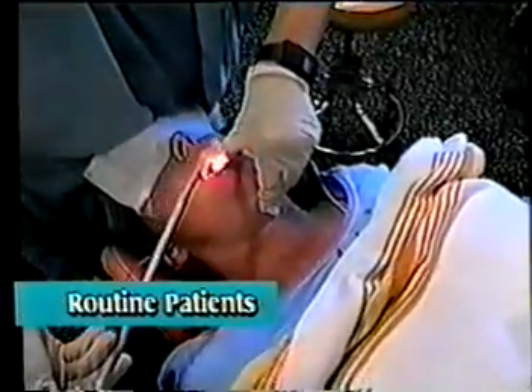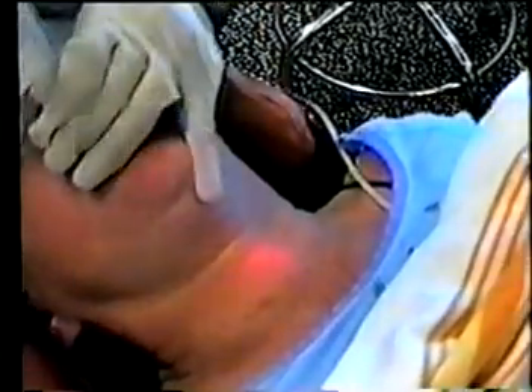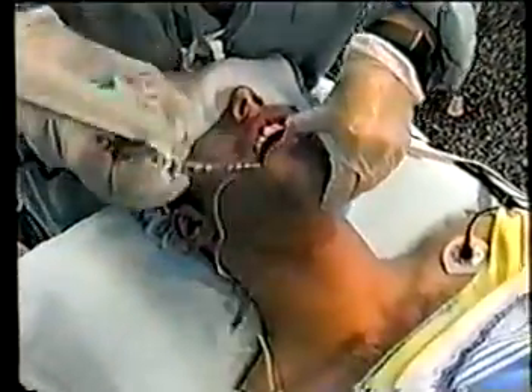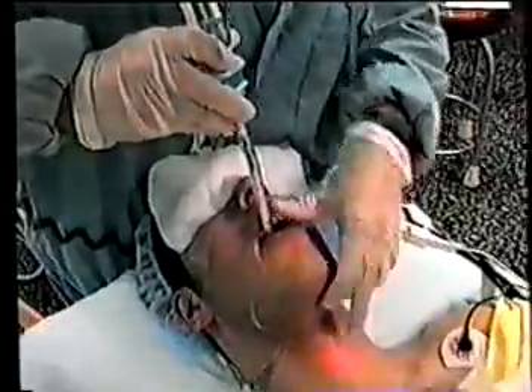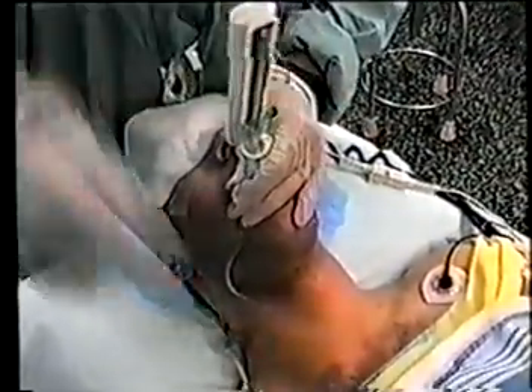Light-guided intubation offers benefits for routine patients as well. Research comparing the technique with laryngoscopic intubation has shown that it requires less time and causes less of an increase in the patient's hemodynamic status. Also, because light-guided intubation when performed with the TrachLite requires only modest finger pressure, it has been shown to be far less traumatic than laryngoscopic intubation.